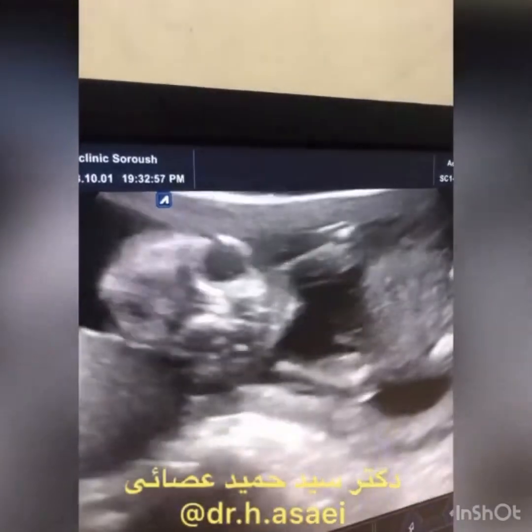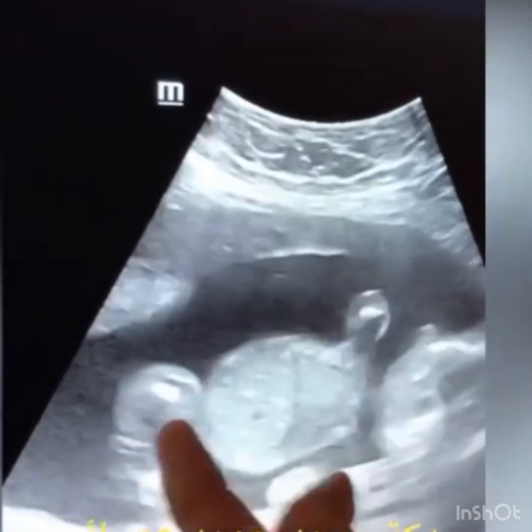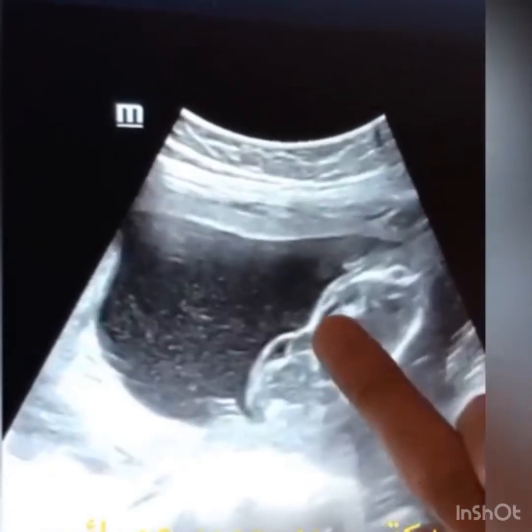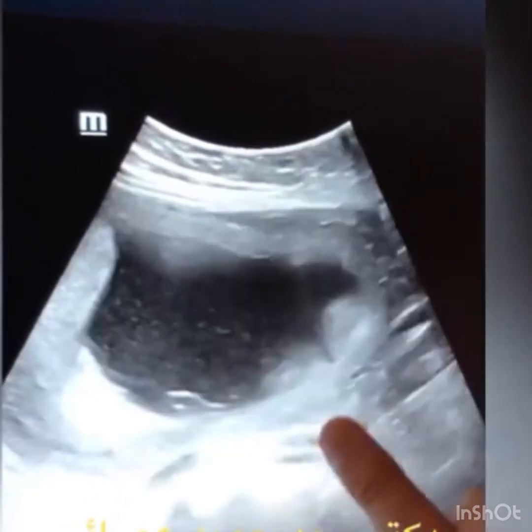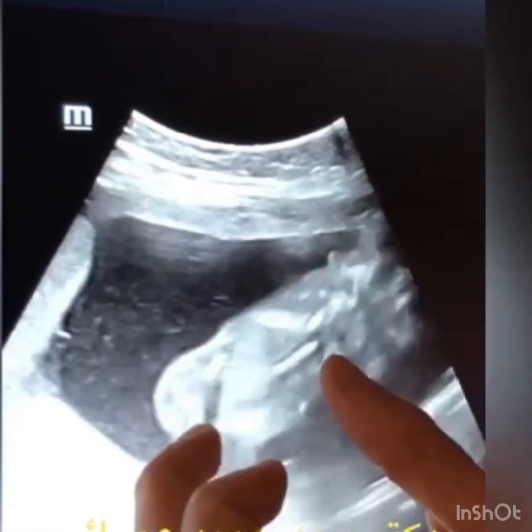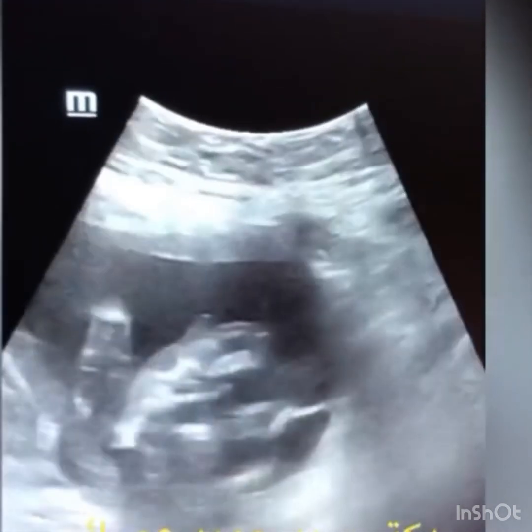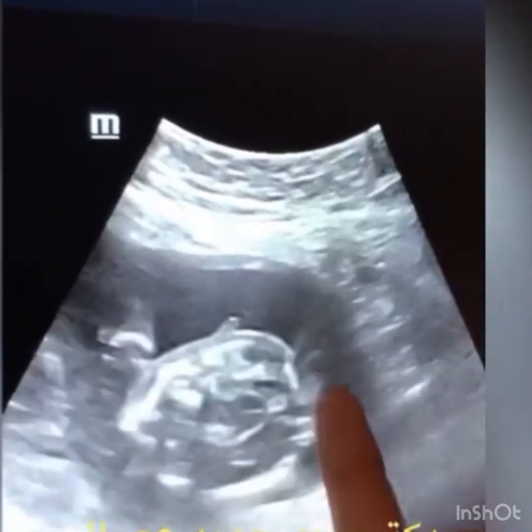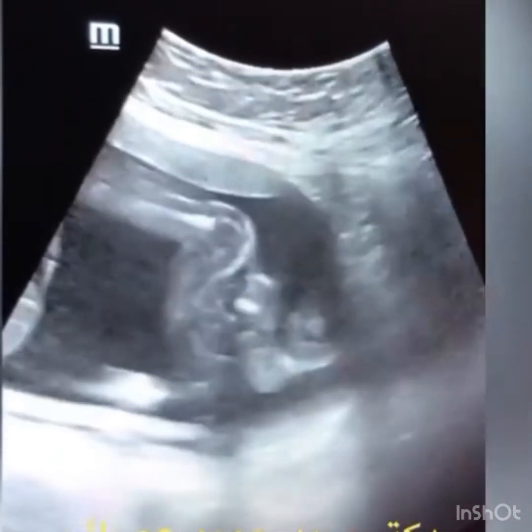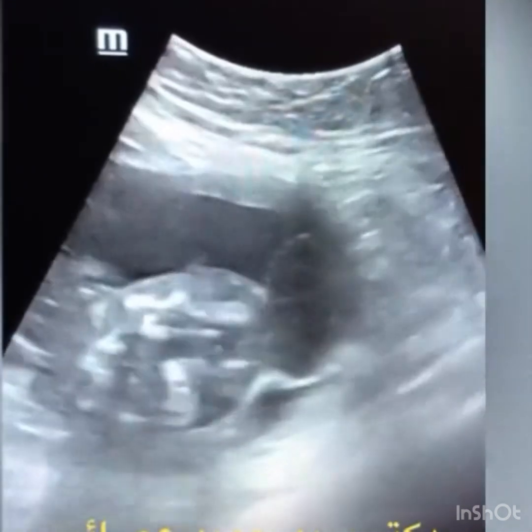The eyes, lips, and both hands are also seen. Here is another interesting case — a twin pregnancy, one fetus and the other fetus here. In the first fetus, we can see microcephaly with brain tissue herniated posteriorly and a big defect in the posterior part of the calvarium. This fetus also has a short spinal column. Reviewing the other fetus, we can see unfortunately the same defect in the posterior part of the calvarium, with a cystic structure containing brain tissue herniating. So the second fetus also has an encephalocele.